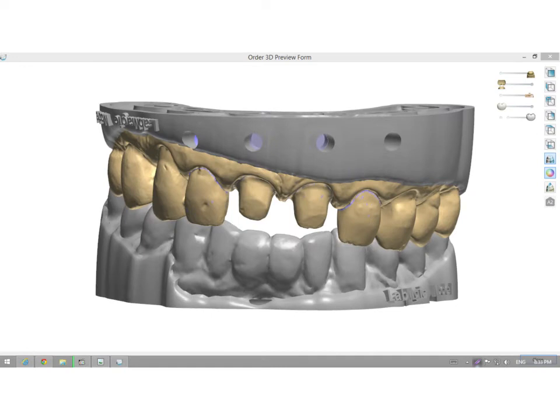Computer-aided design is a fundamental step in any dental intervention involving digital technologies. Images registered through different acquisition systems such as scanners and CBCTs are managed in specialized computer files, able to store 2D, 3D, and even color information. These files can then be processed with specialized software in order to virtually plan treatments and design prosthetic restorations.